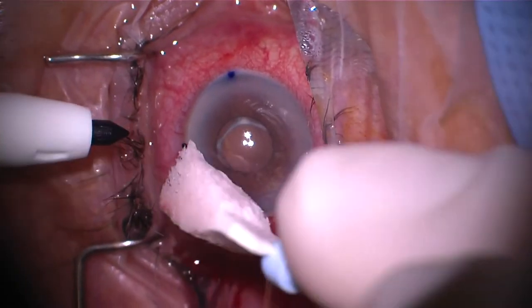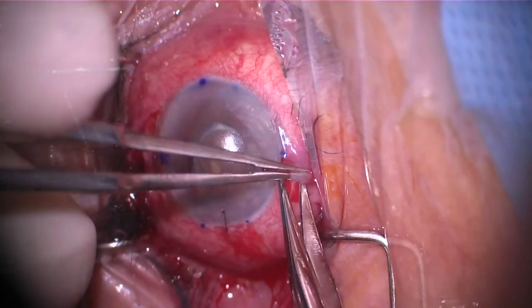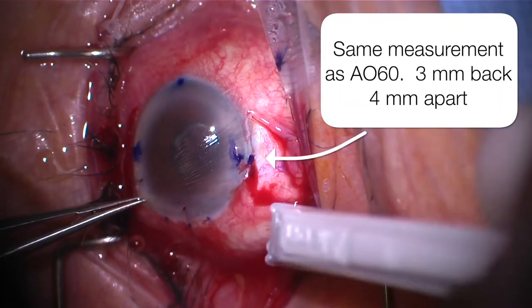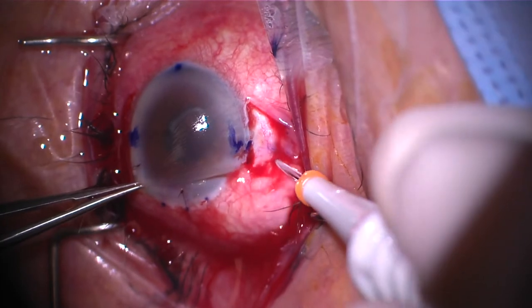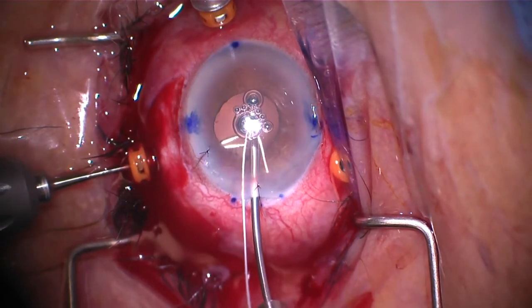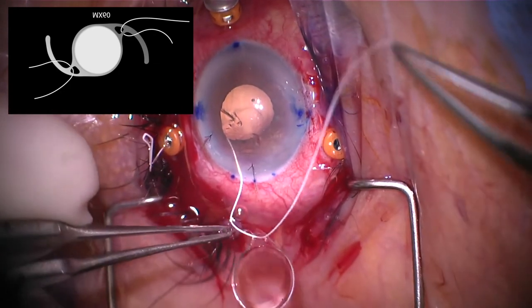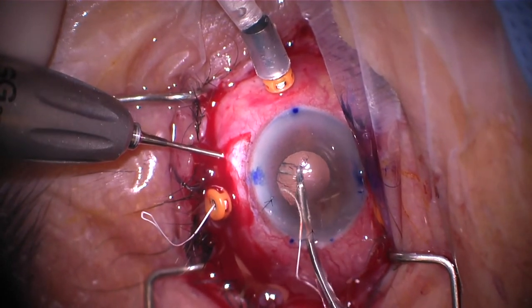With the opacification of the hydrophilic acrylic material, we've been looking for better solutions for small incision sutured IOLs. Another technique is to use a hydrophobic acrylic IOL — the MX-60 from Bausch and Lomb in an off-label way. The incisions are the same as the AO60: centered across the visual axis, 3 millimeters back, 4 millimeters apart. The suture lacing pattern differs: the suture goes over top of the haptic, through the little cutout, and then back over top of the haptic again, so there's no induced tilt.